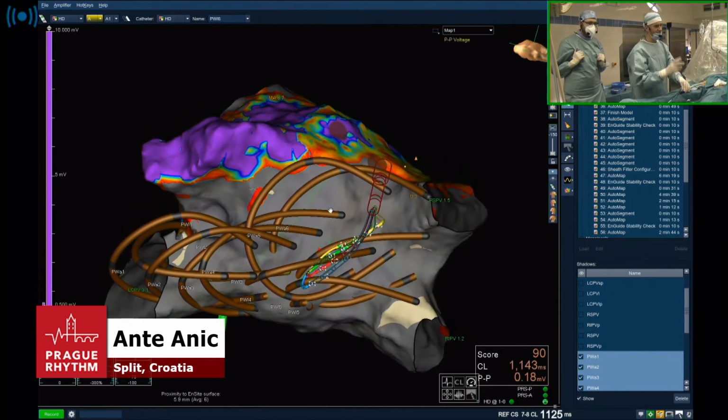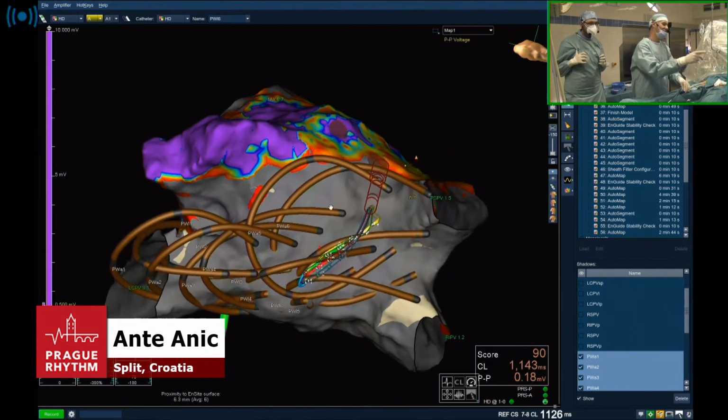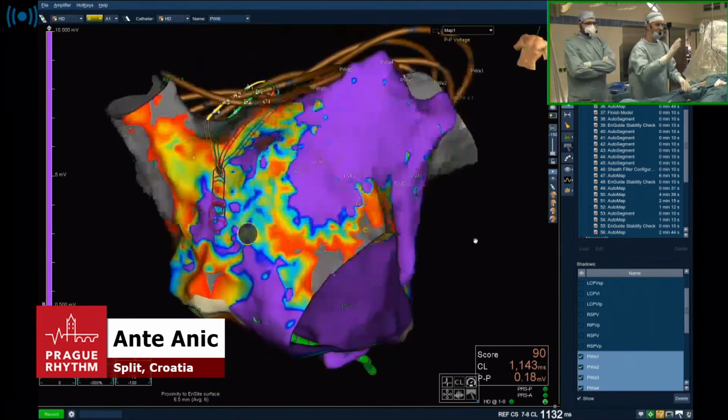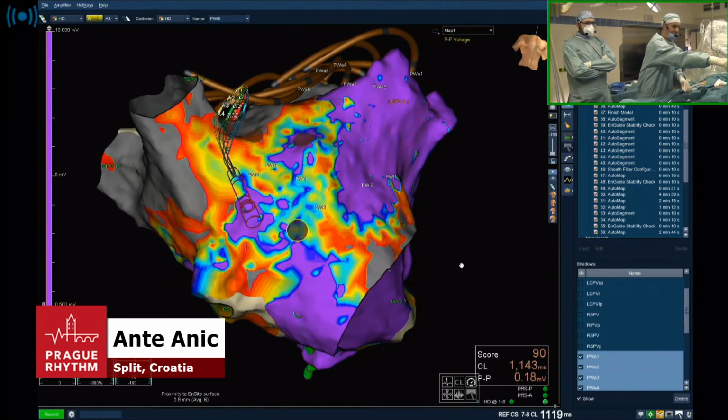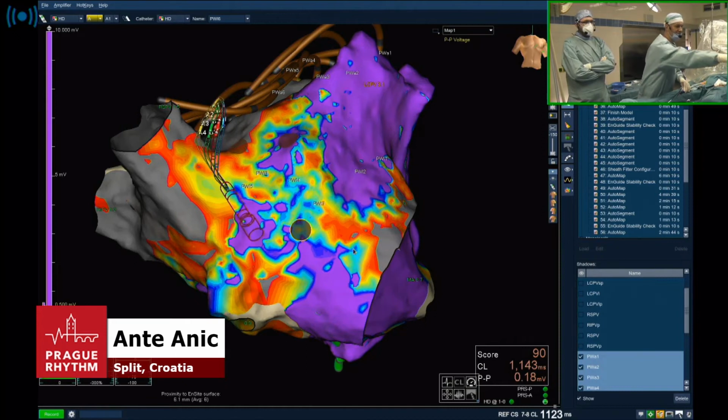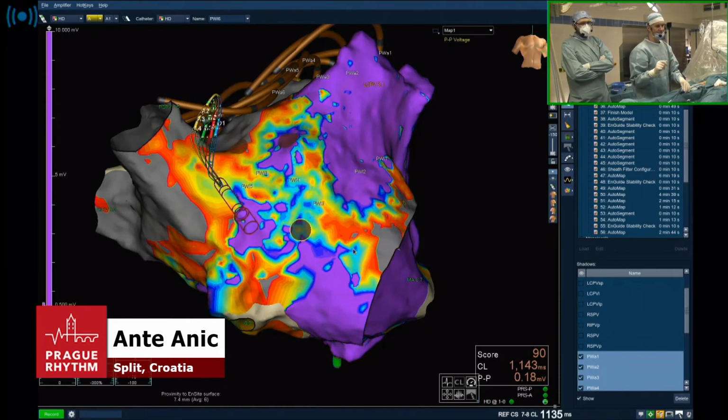And now, please mind that the patient had anterior fibrosis. Can you go anterior? Patient had anterior fibrosis, and this is the map we have at this point of time. So now that we finished the posterior box, we are scared that this anterior fibrosis can perpetuate and serve as a substrate for the atypical flutter.